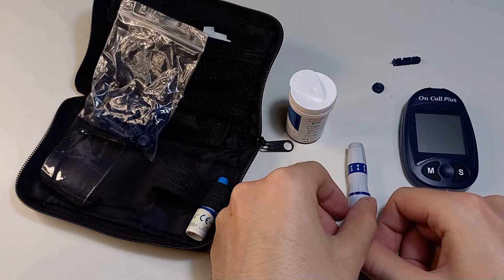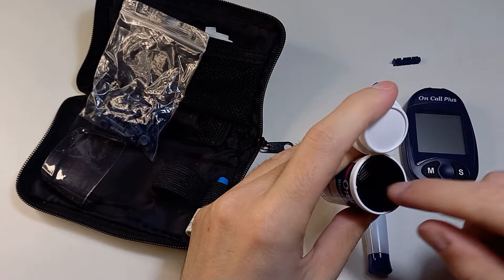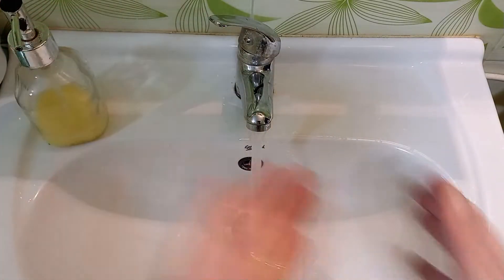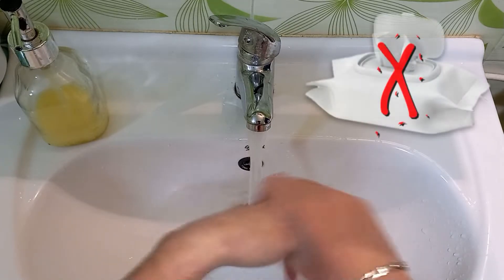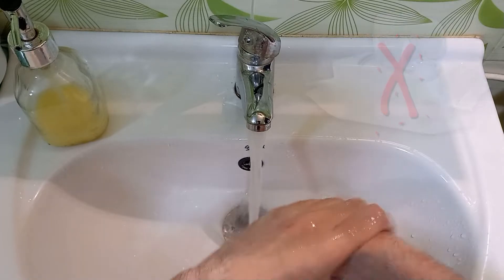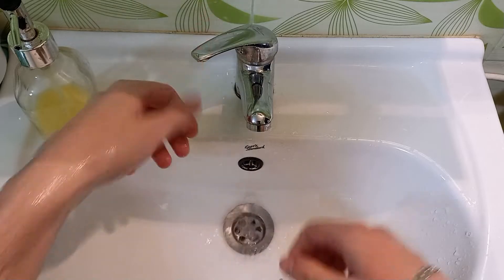Now it's time for the test. First take one strip from the container. Wash your hands with warm water and soap, then dry them with a clean towel or a paper towel. Don't use wet wipes because they may contain certain chemicals that can affect the results.